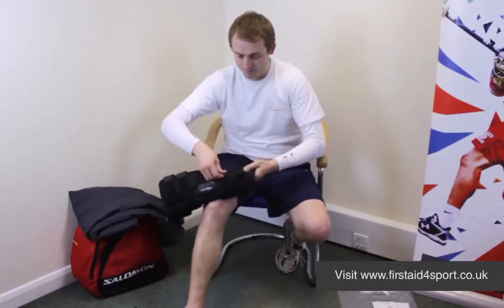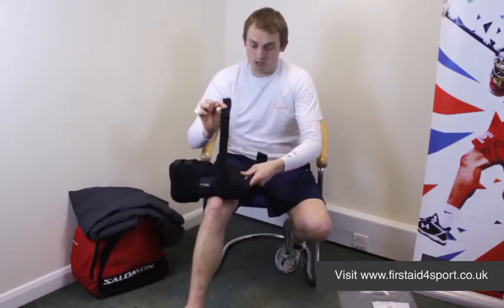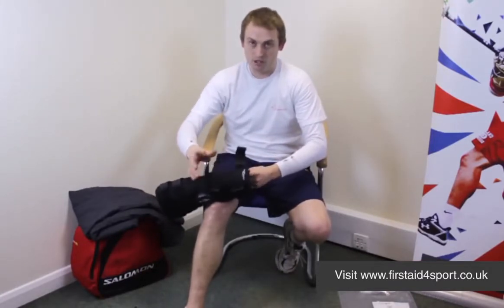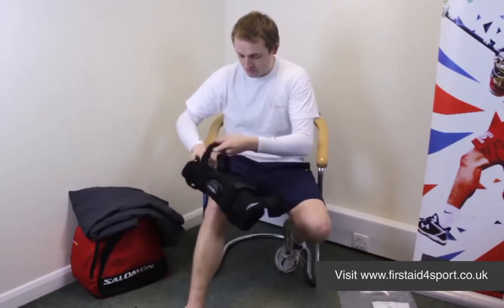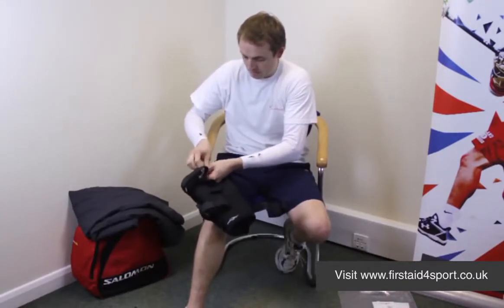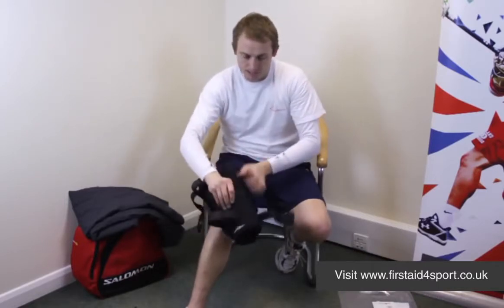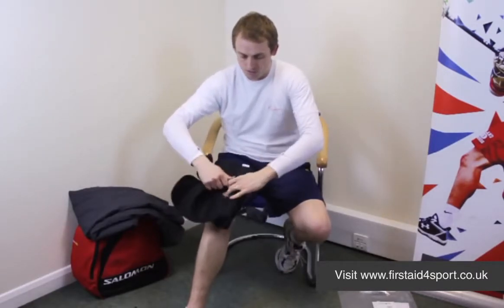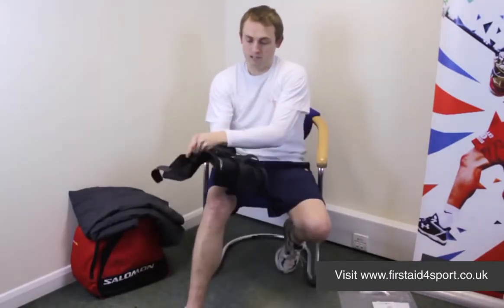So you simply undo the straps. A quick tip: when you undo them, just stick them back down again, and then when you're trying to put it on, it makes life much easier because they don't stick to each other. So simply undo the Velcro straps, and then the brace actually opens up so it goes completely flat.